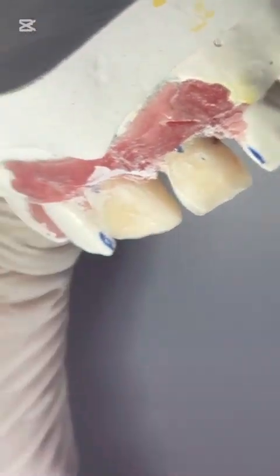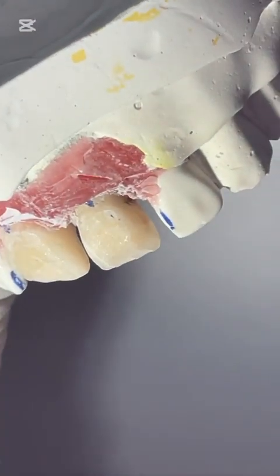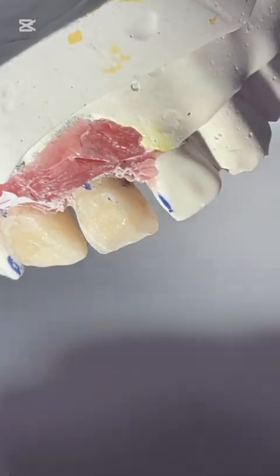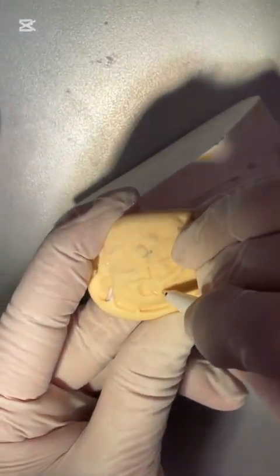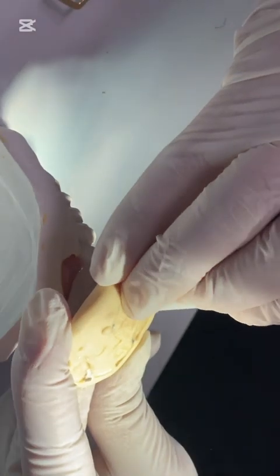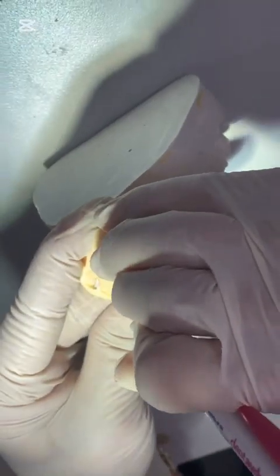Now I checked all the surfaces. They are clean and ready for etching. Now again I will check with my silicone index. Look at the silicone index here. Here is the midline. Here is the incisal edge. Here is the distal wall.